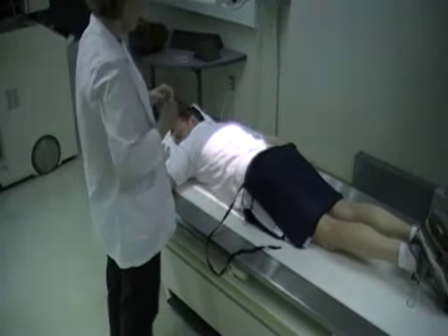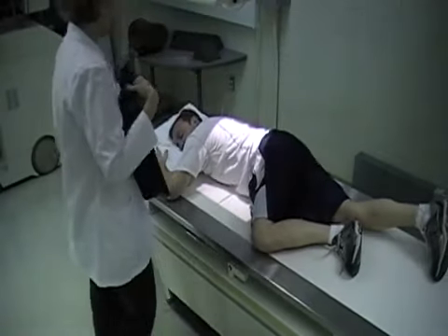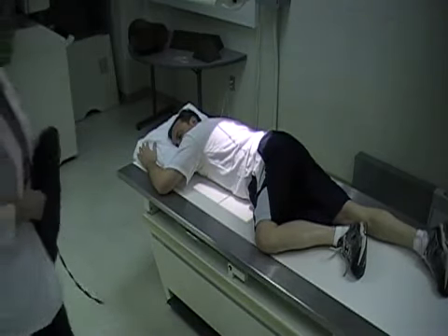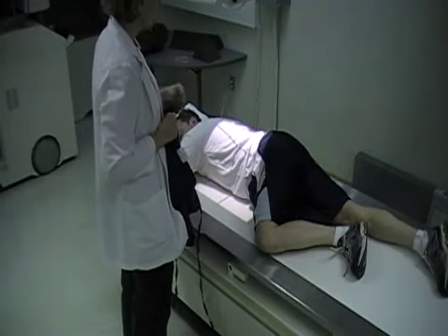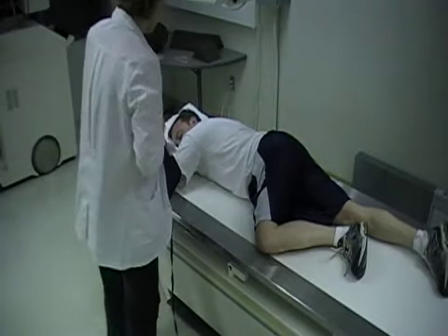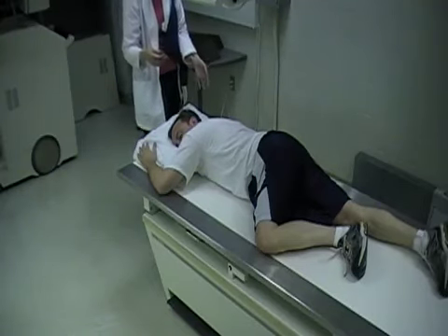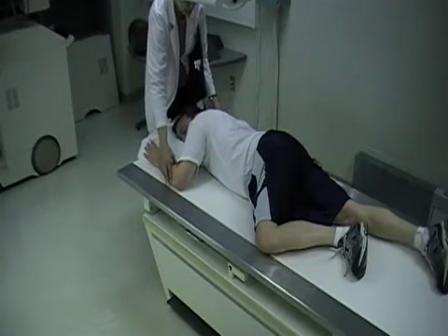Alright, now we're going to do the RAO for the stomach. Your patient is going to be turned up onto that right side, at 40 to 70 degrees, so you have a pretty good range to go with. Again, check your patient and make sure that the hip and the shoulder area are in the same plane. So I'm going to bring his shoulder up just a little bit more. There you go.